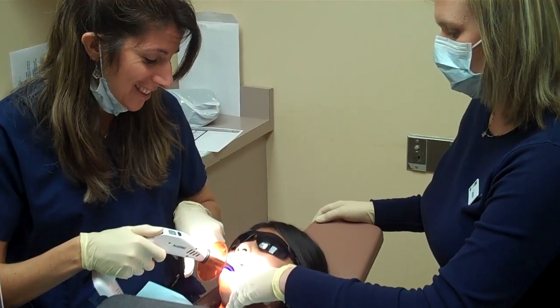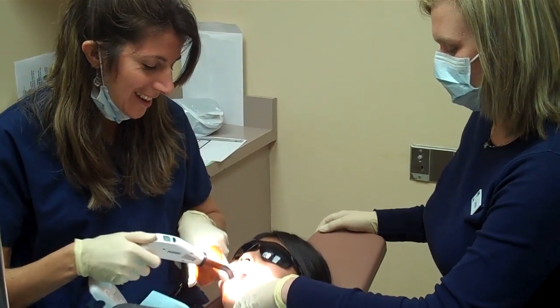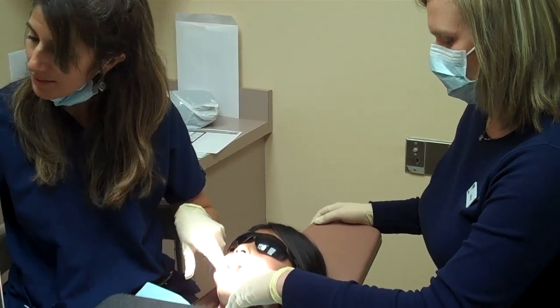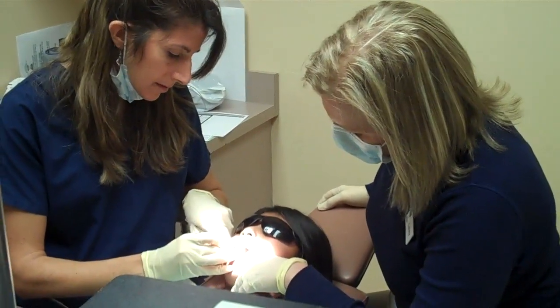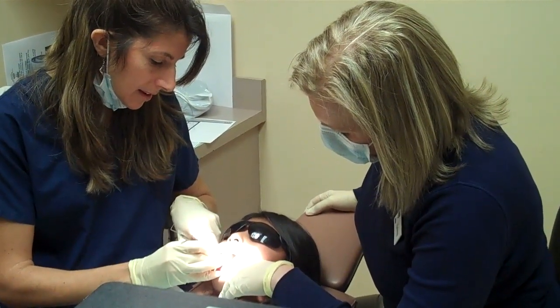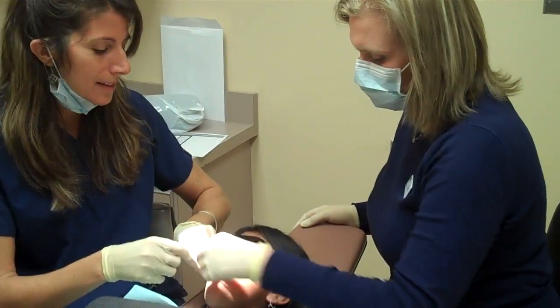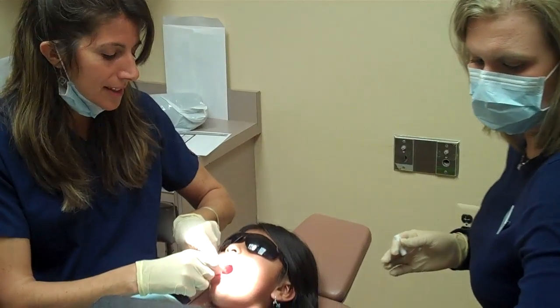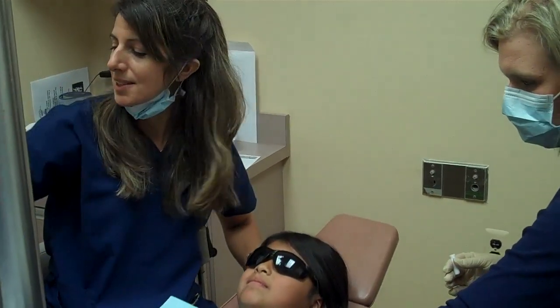She's only eight years old, third grade. And that's it — let me just check it. Make sure we're happy with the result, and it looks excellent. Then we take everything out, and we're going to let her rinse out. And that is how we put sealants on teeth.